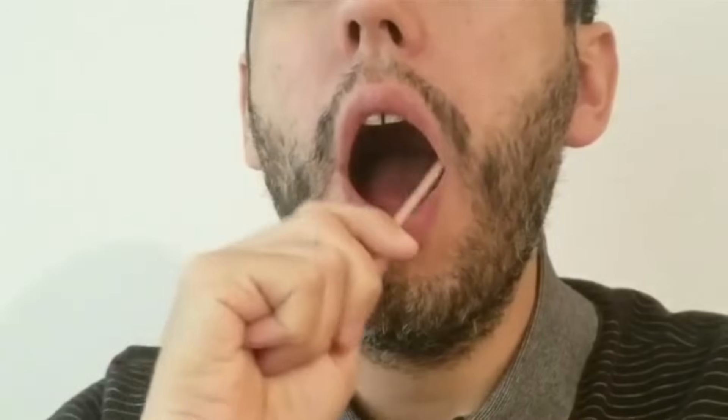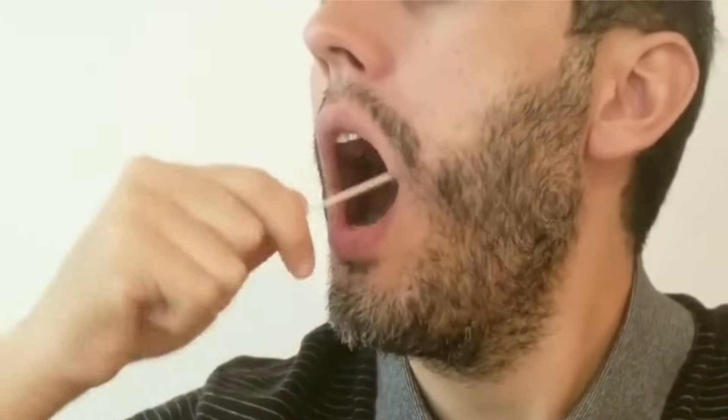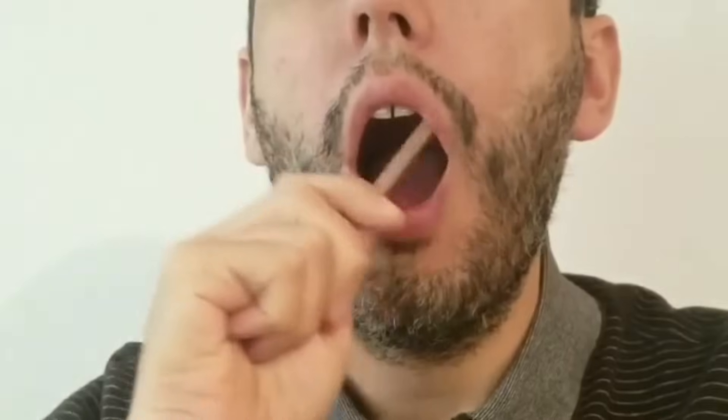Step number 3: Start by using the first swab in one of your upper cheeks inside your mouth. Be sure to brush inside the cheek and swab in between the cheek and gum for 30 seconds. Swab in a rolling motion, moving the swab up and down while also rotating. It's very important to rotate the swab with your fingers to collect a good amount of DNA-containing cells.